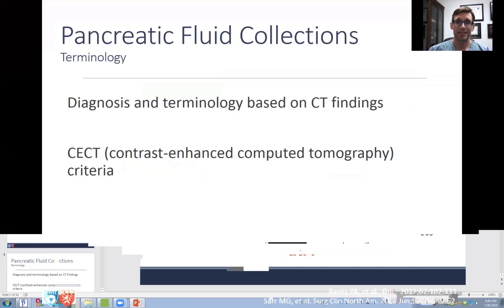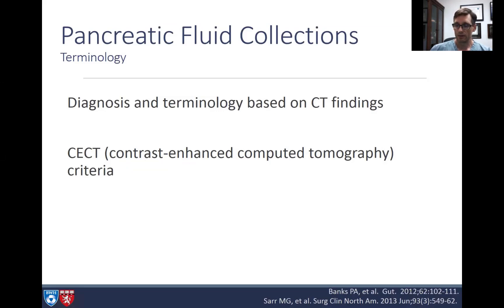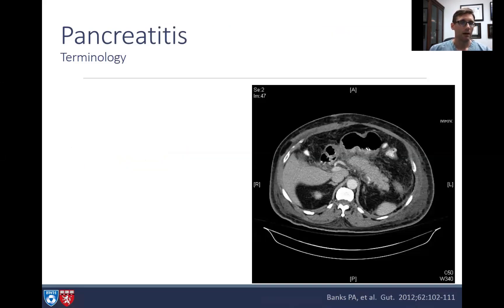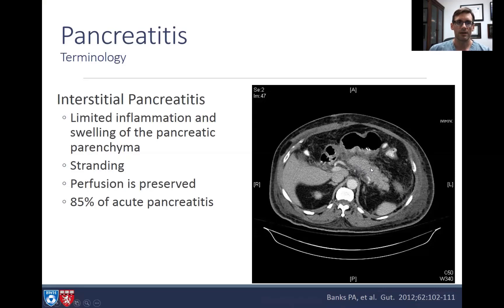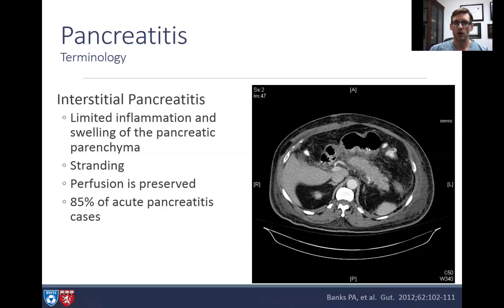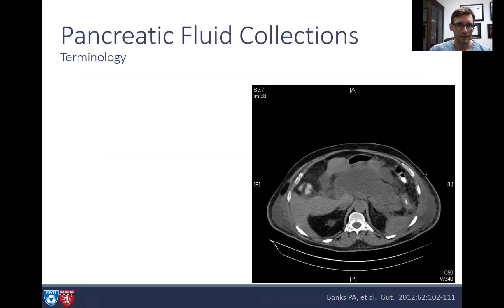Pancreatic fluid collections are typically diagnosed on CT scan and are categorized by contrast-enhanced computed tomography criteria. Here we see interstitial pancreatitis — a boggy, bright pancreas. Inflammation is typically limited to the pancreatic parenchyma or immediately adjacent to it with some peripancreatic stranding.